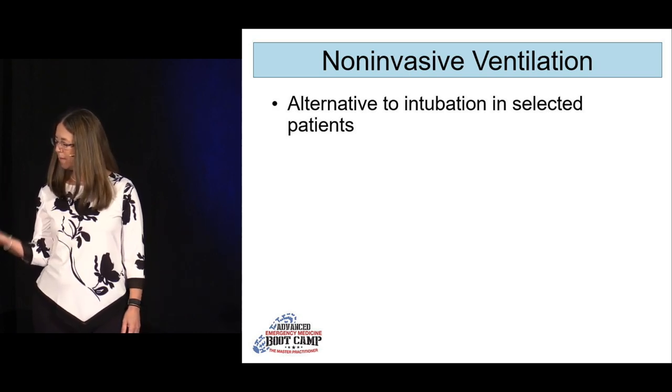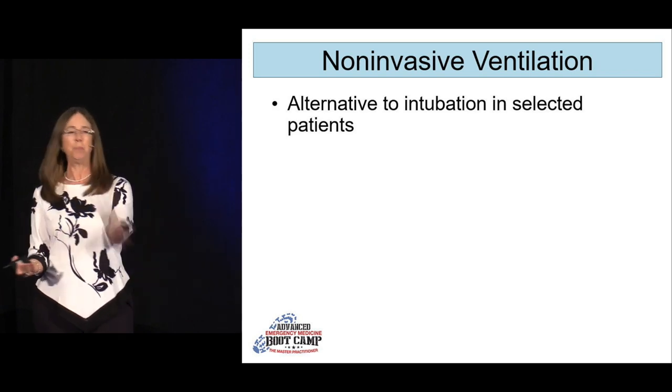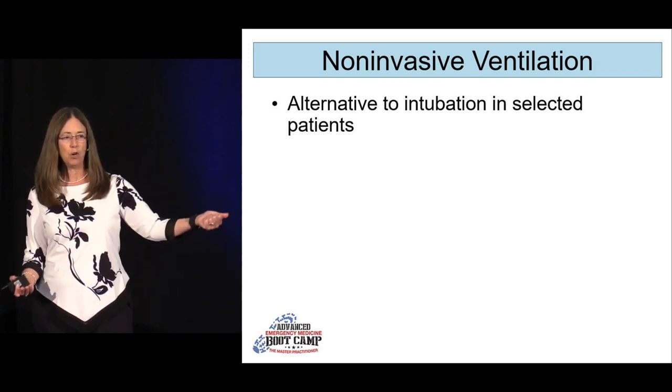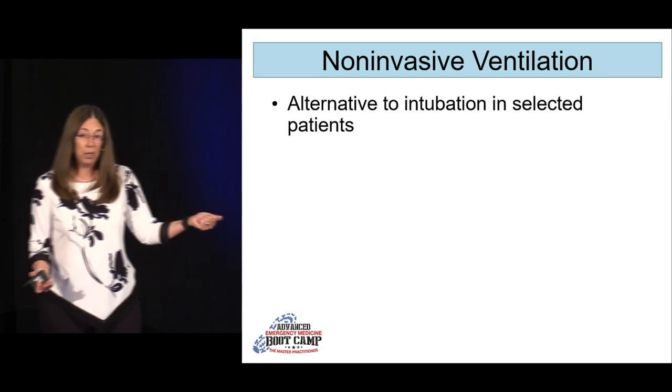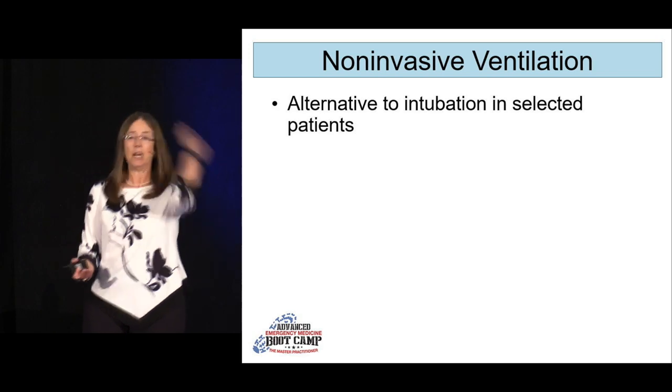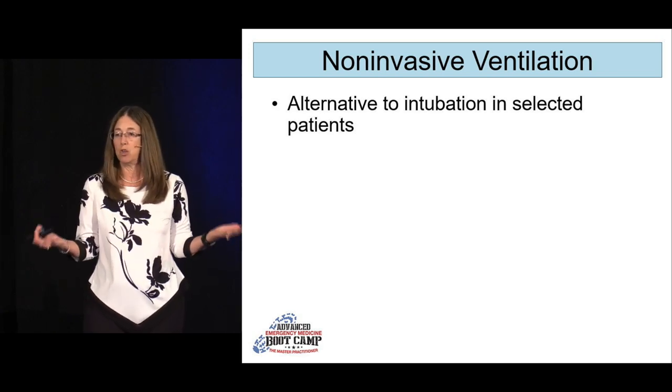and said, well, wait a minute. If I put that mask on that machine, put them together, and just put it on the patient's face and then turn on PEEP, what would happen? What would happen with that? Brilliant idea. Kind of duct taped it to the guy's face and voila. Turned around like a rose. It was fabulous.